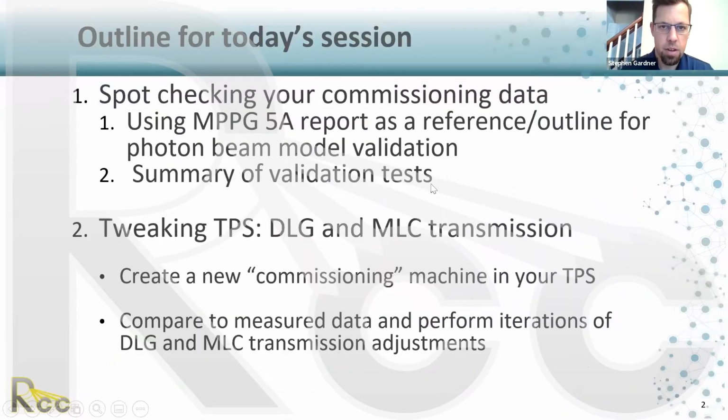Okay, there we go. A little slow on the response, but just a quick outline. We have two parts of this talk. The first part is spot checking your commissioning data. This is going to be more of an overview. And then we're going to dive deep into tweaking your treatment planning system and looking at DLG and MLC transmission.